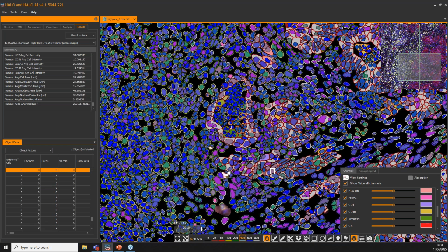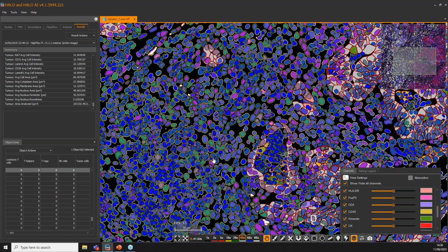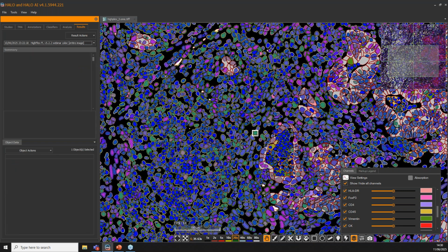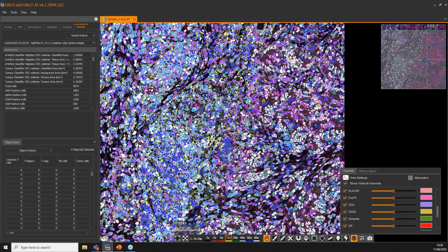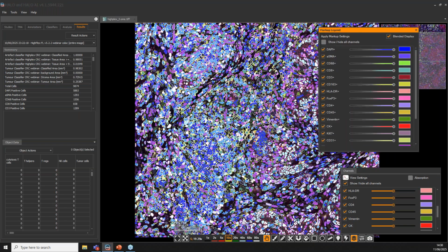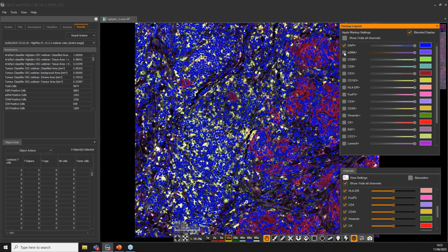Okay, so as I mentioned, this is maybe a bit crowded. If you have all the colors together, you may not know what's what on this mask. So for publications, what you may want to do instead is to export an interactive markup. And this is where it becomes really pretty colorful because every color here is attributed to our interactive markup. So I've actually taken out our markup legend from here, and you can see that all those channels, or all these colors actually, can be toggled on and off at any point.